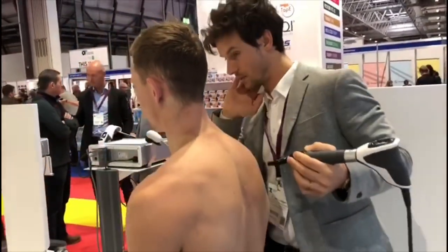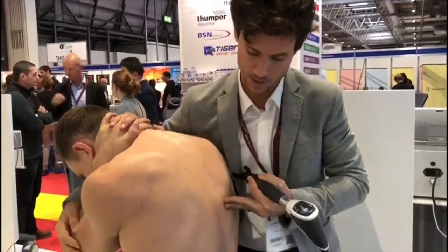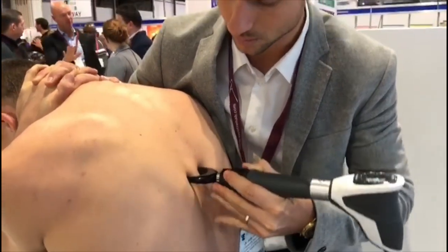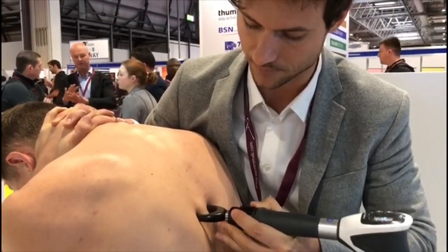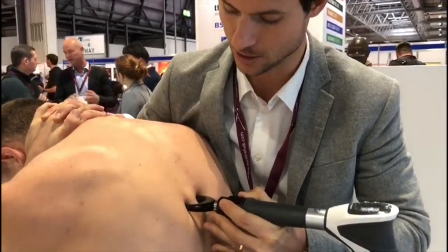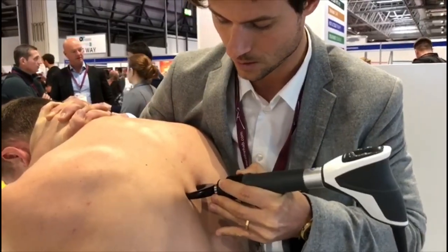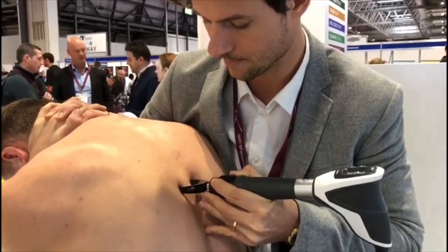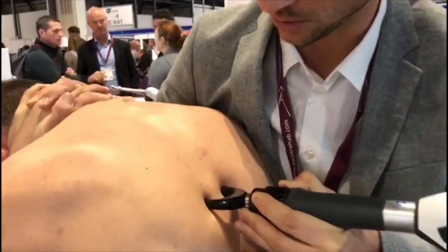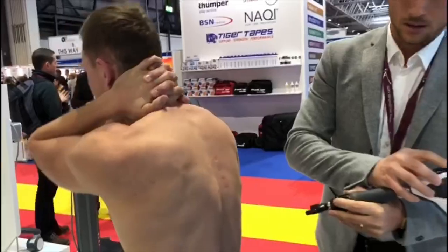So you have the same position with your arms, but we'll flex your body like this, and then we'll try to do the same thing here. It'll be a slightly different angle. Oh, we had a reaction from the muscles. A little twitch. Still comfortable? Yeah. Good. This would be the joints as well, I think. You see there's a twitch in the muscles, but it calms down after a while. So that's okay. Like that.